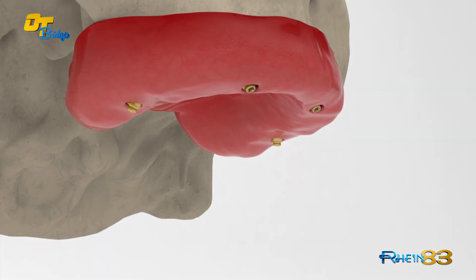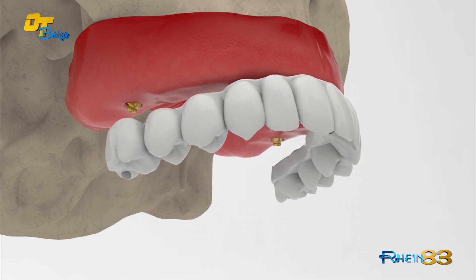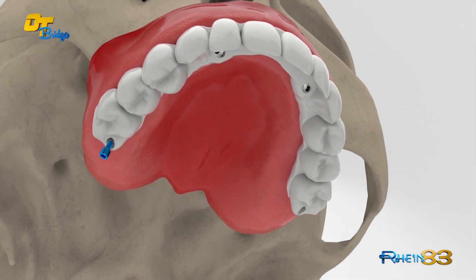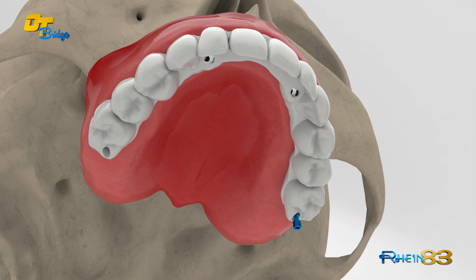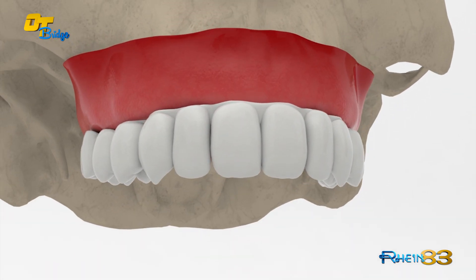The insertion of a temporary full arch begins with the anterior abutments and continues to the posterior abutments. The white plastic sega ring gives primary retention to the denture by a significant click and will be completed with the tightening of the prosthetic screws. This system offers an easy and smooth insertion in the patient's mouth.